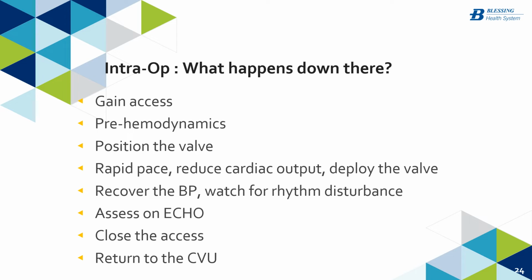It does take both the interventional cardiologist and the CT surgeon at the table to place the valve. So they're at the table, and the radiology tech is at the table, passing wires. Typically, interventional cardiology gains access to the femoral site that we're going to use. We will get some pre-hemodynamics with echo, whether that's transthoracic or TEE, and then we will start to pass the valve.